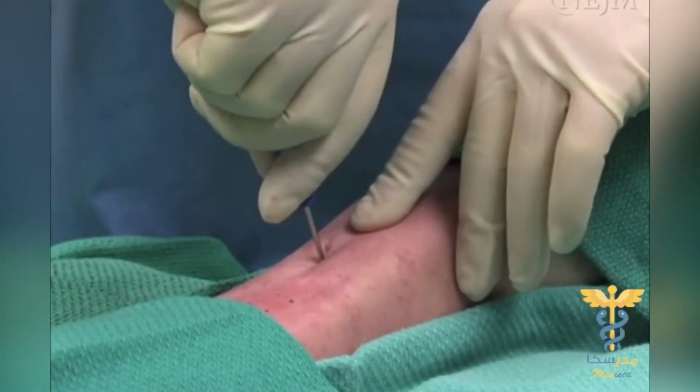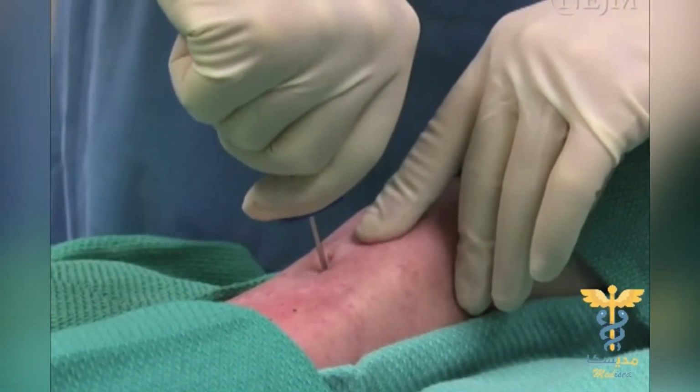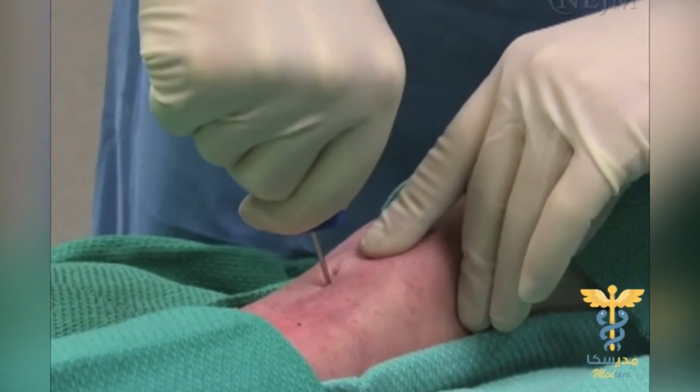If the intraosseous needle is inserted manually, the medial aspect of the distal tibia is the preferred site because of its thin bony cortex and the small amount of overlying tissue. A substantial amount of force and a large bore needle are required to manually penetrate the bone.